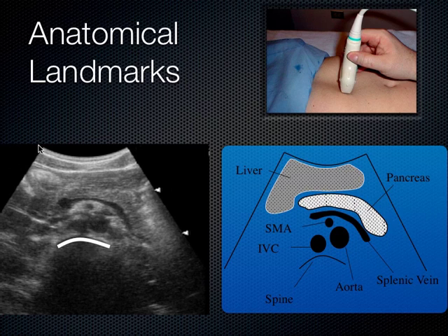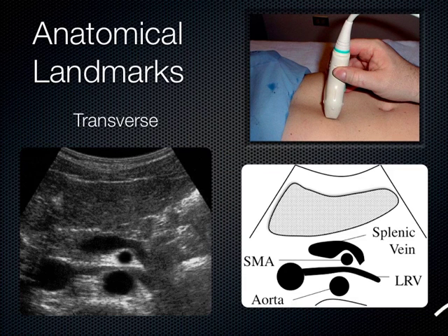Now, based on this probe's footprint, which probe do you think we're using? C60, exactly right. So we don't have those upstairs. We got the P21s, and they do okay, but ideally, when you're talking about the aorta, the C60 does make the best images.